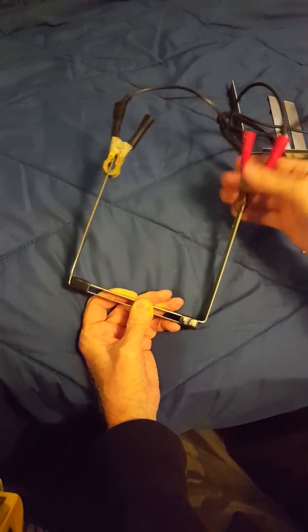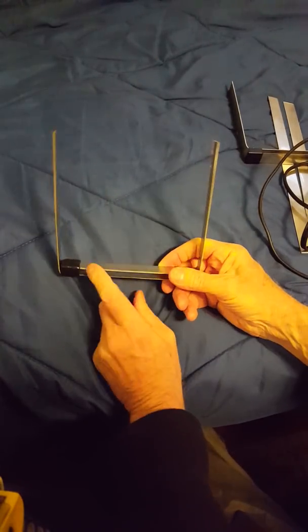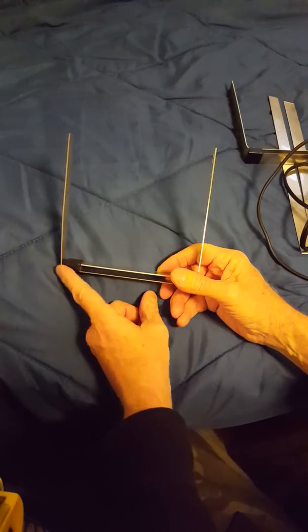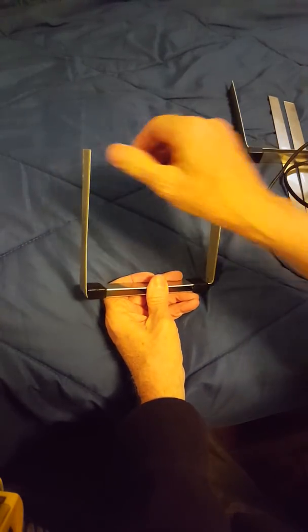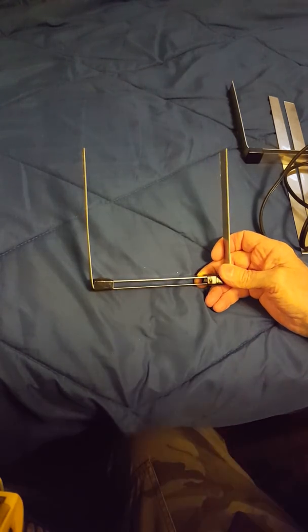this thing down here. And remember that what you do is you monitor these and you wait until they get a little bit questionable, and then you cut the thing apart, invert it, invert this one here. Remember to tape off the ends again, just like you did before. And there you have it, electrodes.